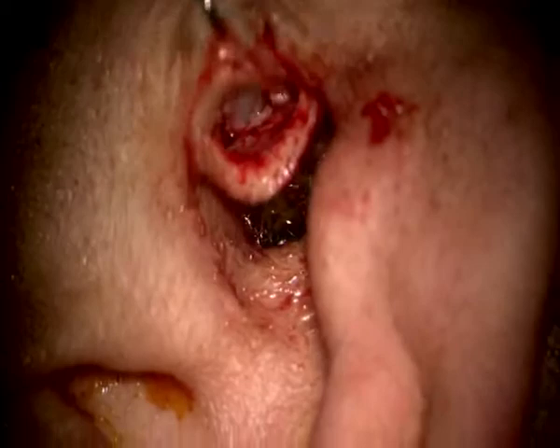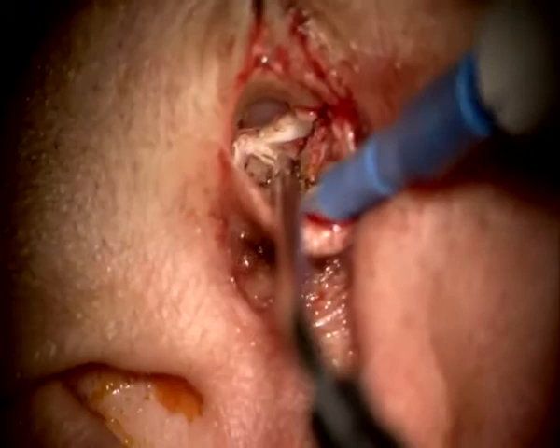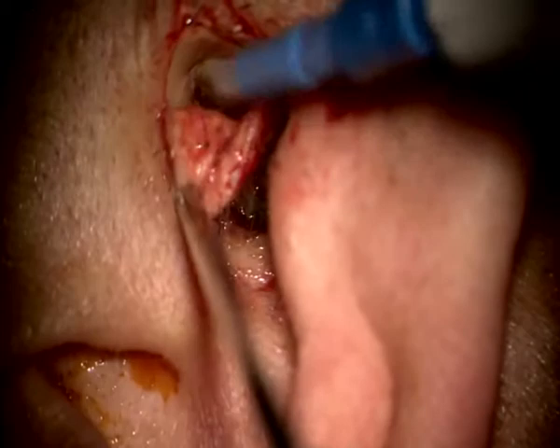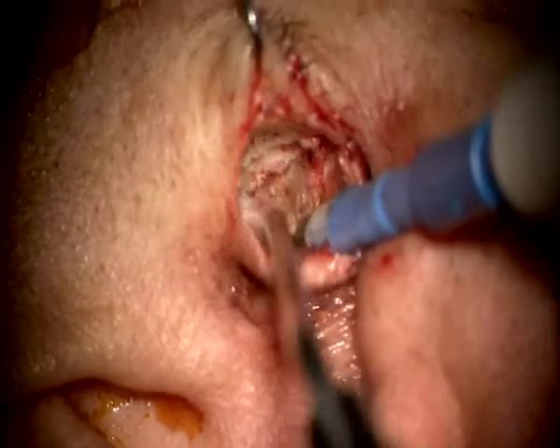All right. So, let's see the field. The idea here is that you need to make it dry. The most irritating thing that you could do in this area is a hematoma. At the same time, when you cauterize, do not cauterize the cartilage, because if you cauterize the cartilage, you do get a bit of chondritis, and it could be also very frustrating for you and for the patient. So stay away from the cartilage. Even if you want to cauterize, you want to just lightly touch it, but don't burn the cartilage.